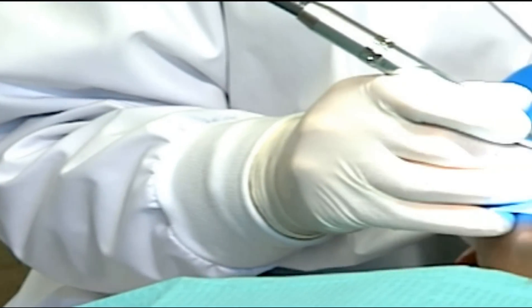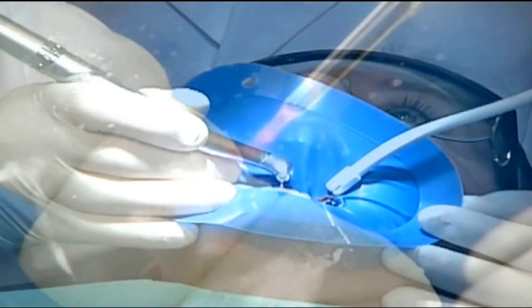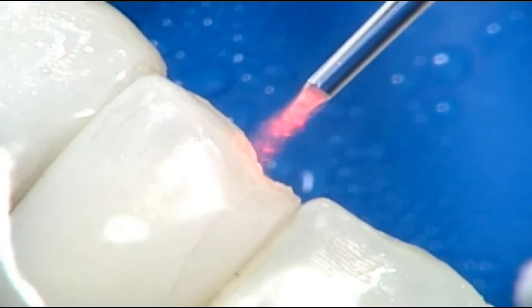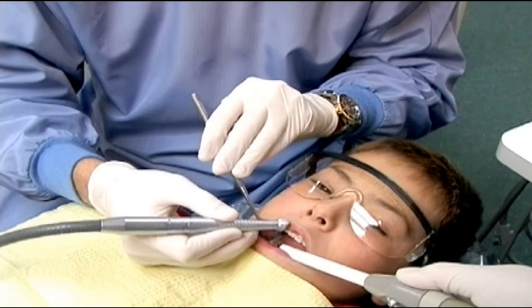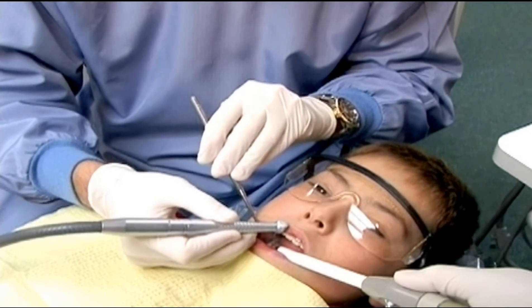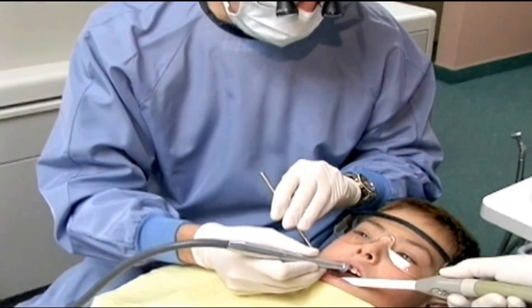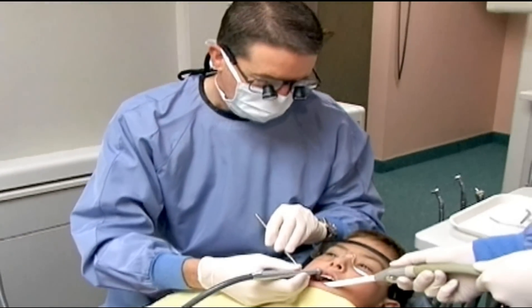With an MD in your practice, you can perform surgery precisely without heat, without trauma, and without damaging adjacent tissue. So forget everything you know about soft tissue surgery, because the MD is fundamentally different from the scalpel.